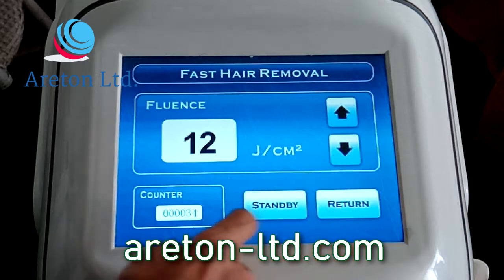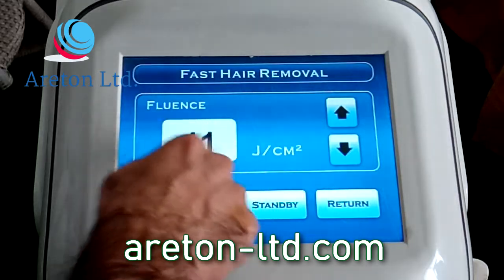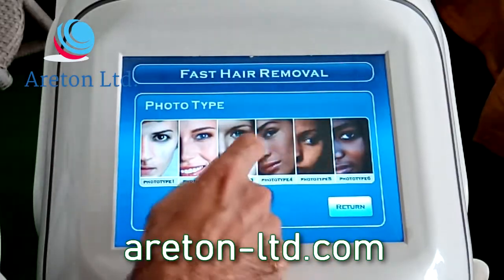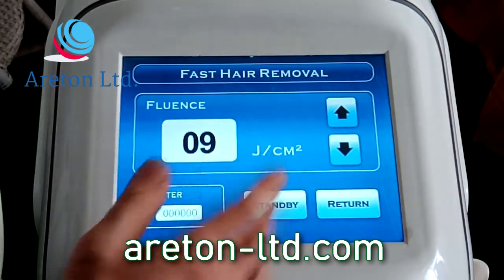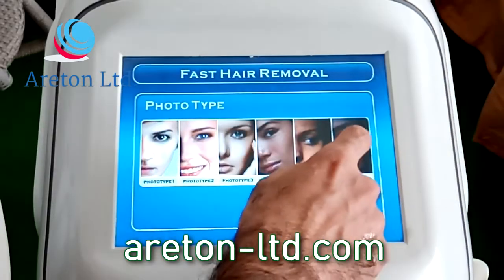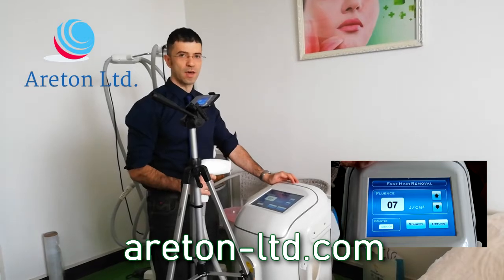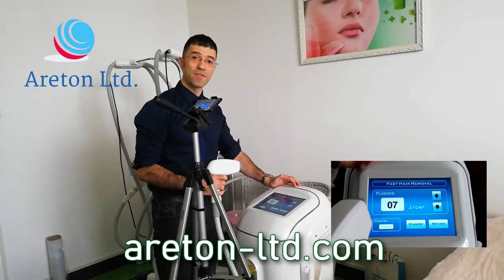Whereas if I go and return, we're going to go into skin type 2, then the maximum is 11. I can actually go down, but I cannot go up. Then I'm going to go back, and just for an exercise I'm going to go to skin type 4, and we can see that the fluence, which is the power level, the maximum is 9, and we're going to return, and then we're going to go to skin type 6, and the maximum is 7. Why is that? Because the only parameter that we can control in this case, when we're treating the different skin types, is the power level.